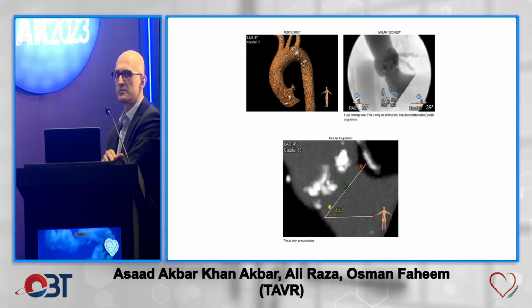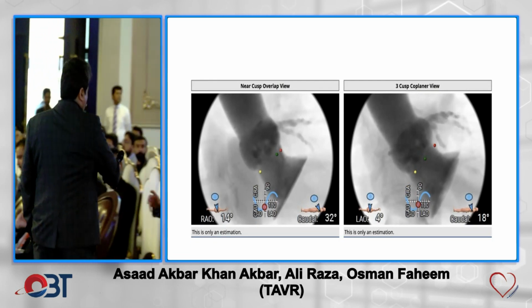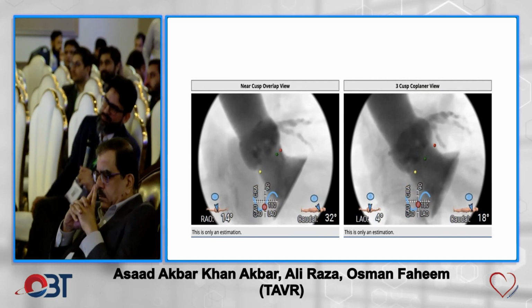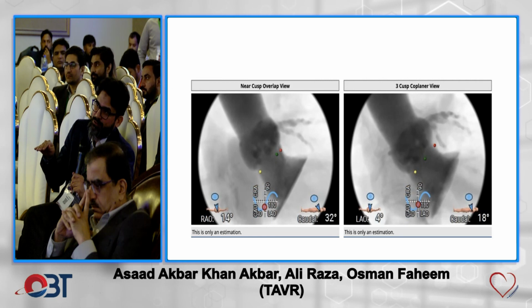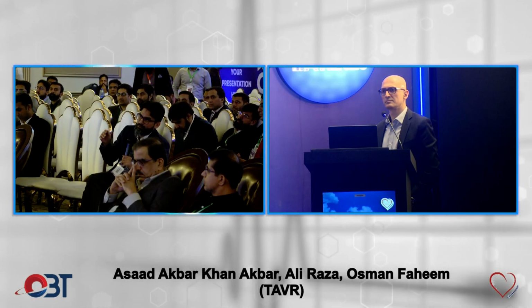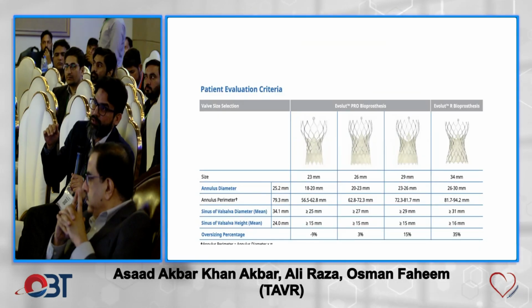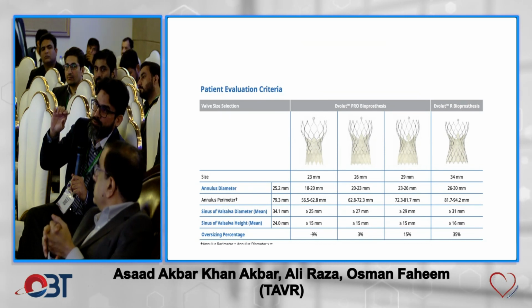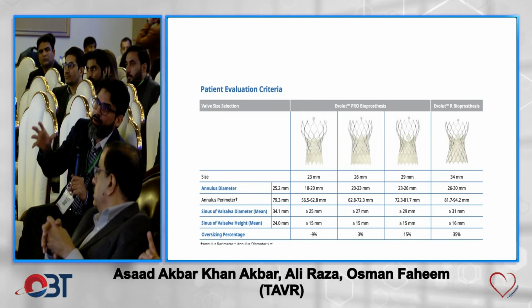So Abdul Hakim, because we commented on that as well, I think oversizing and undersizing for the bicuspid, what do you think? See, it comes down to where you're measuring. If it's a bicuspid and it's calcified, understand your anchoring point, if you're going to use the cusp overlap technique, is the leaflets itself. So if your annulus perimeter is say 86, and you're thinking of a 34, but you go to the intercommissural distance at 4 to 6 millimeters above the annulus, and you're getting an ICD of say 23, 24, a 26 valve is good enough. You have to be very careful because with bicuspids, the anchoring point is not the annulus. If you put a 34, it's going to be so constrained, you can balloon it all you want. It is not going to.